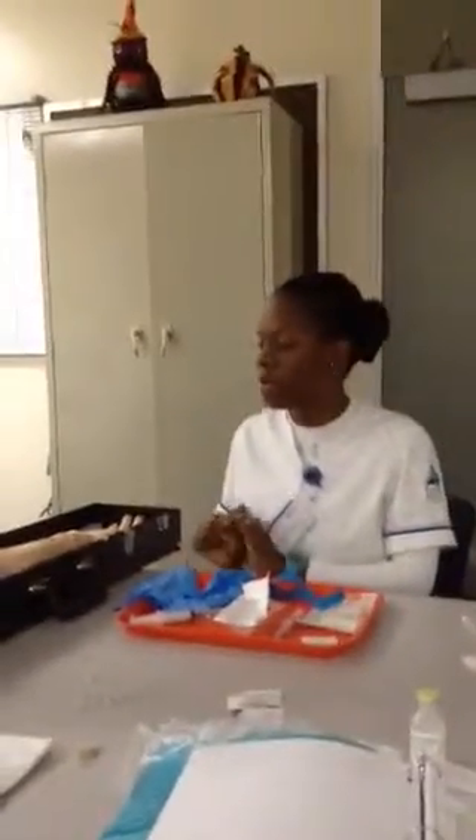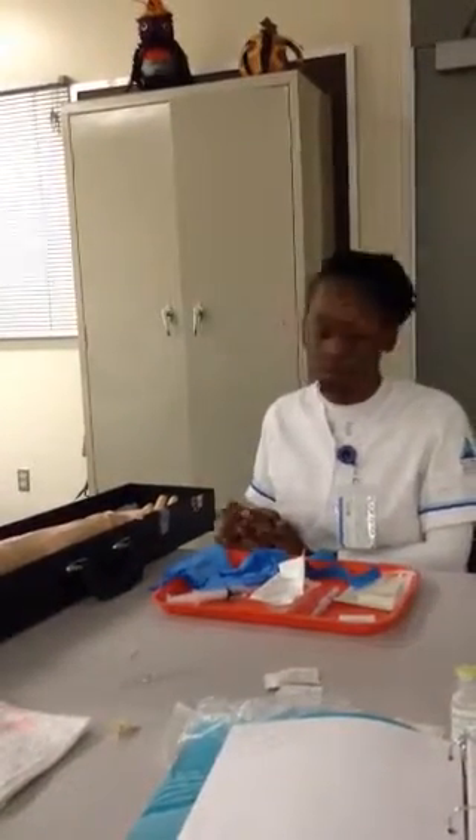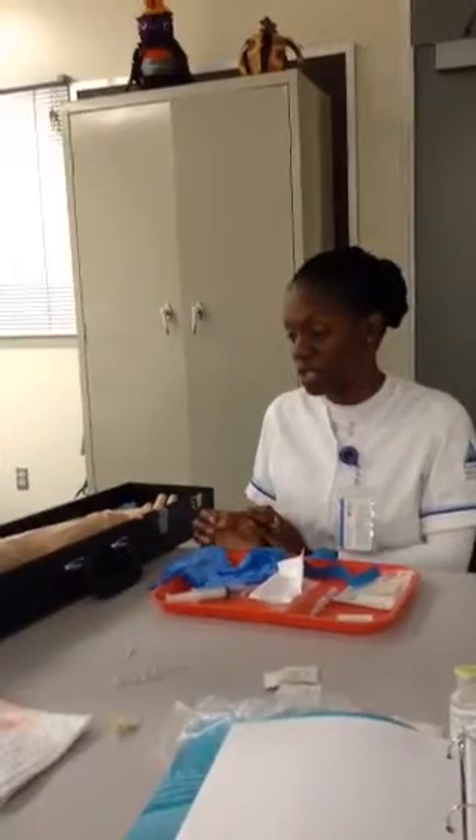Starting in the med room, now I'm in the patient's room. Hi, I'm Brandi, your nurse. Can you tell me your name? John Doe. How old are you? 34 years old. Your date of birth? 7/1/80. Do you have any allergies? No, ma'am, I do not.